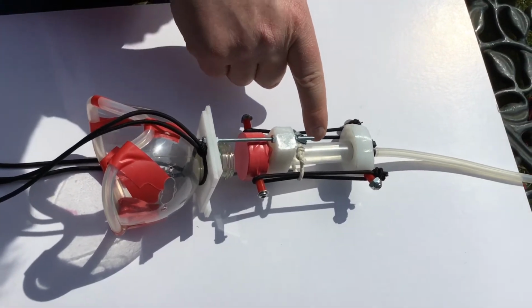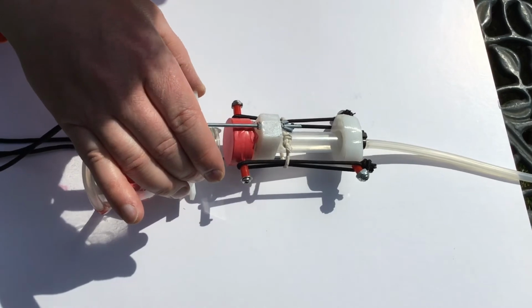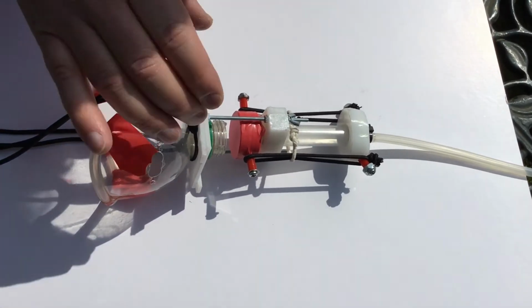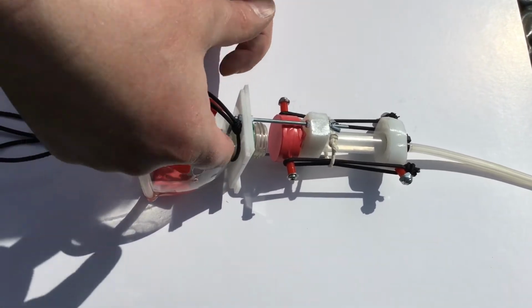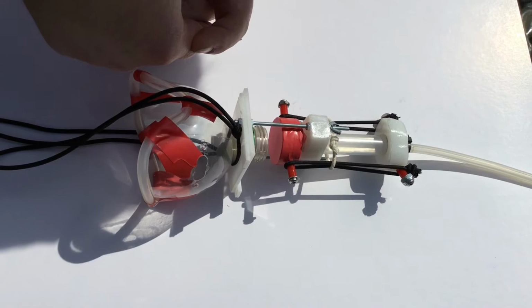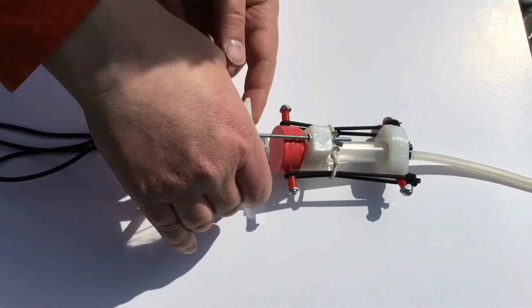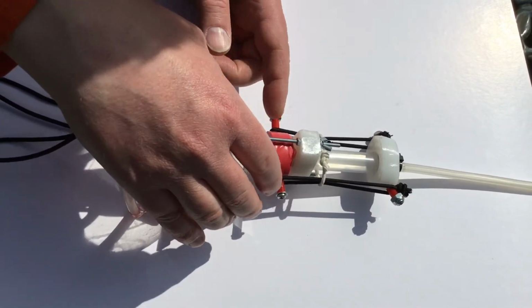To enable the syringe to attach to the bottle, we had to make a collar to go around the collar on the top of the bottle, but that collar had to be split into 2 parts so it could slip either side of the collar on the bottle, and then bolts run through it to hold it in that location, screwed rod run through it to hold it in the appropriate location.